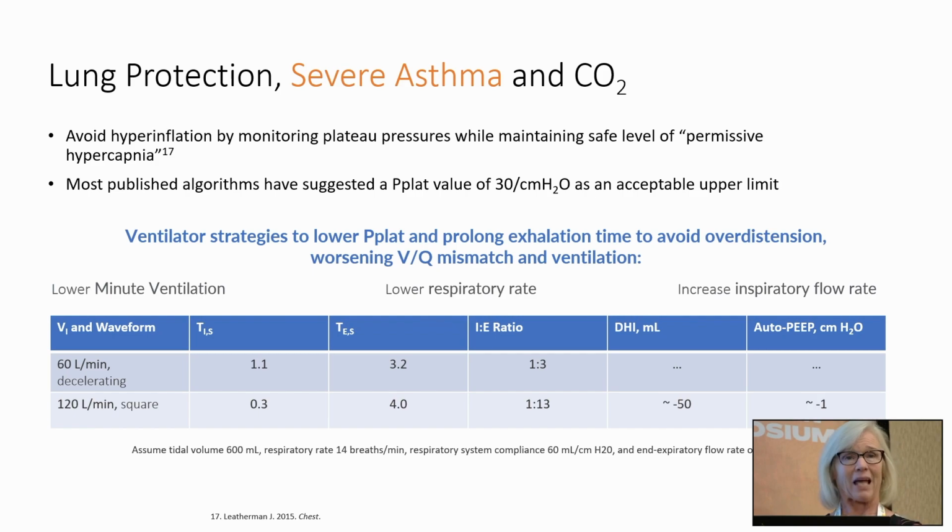Well, how do you know if you need to go up on the rate or down on the rate? If you can continuously monitor your CO2, that's really going to help guide you so that you'll know whether to go up or down. There's a couple of recommendations here: increasing your inspiratory flow, decreasing your I time to give that longer exhalation time, and again, using high frequency techniques to help with those patients who have high peak pressures.